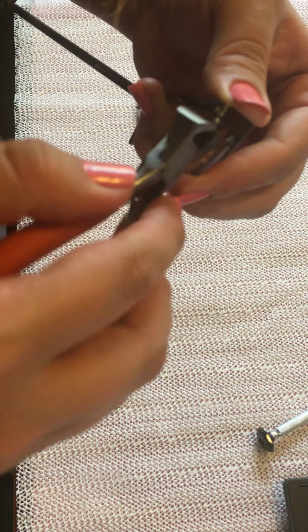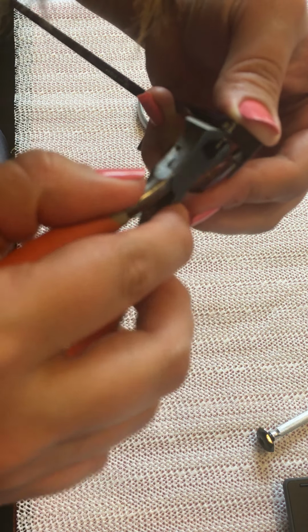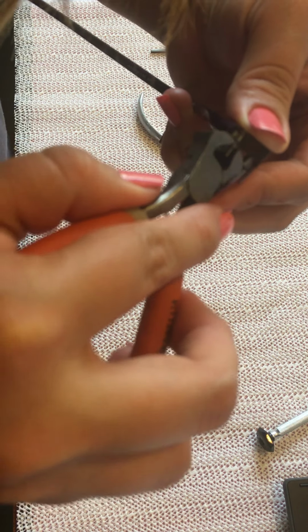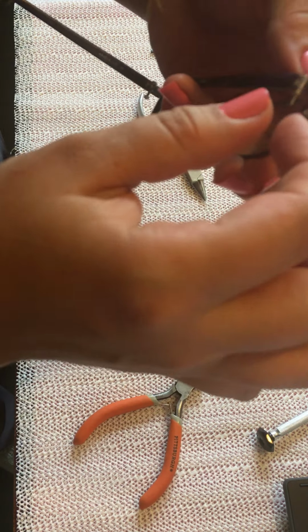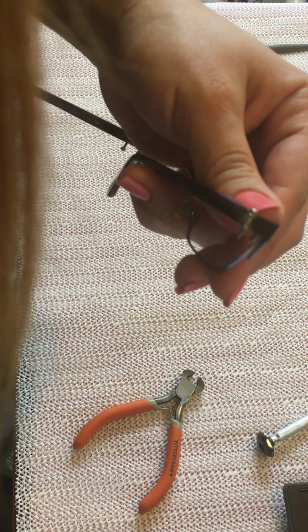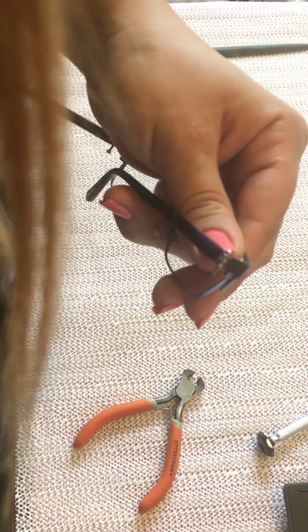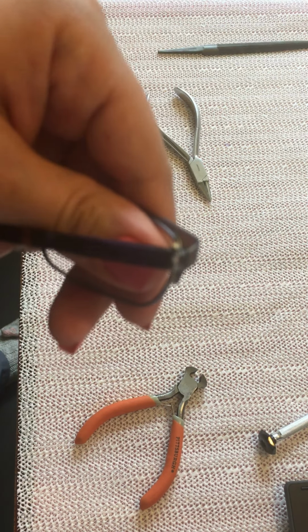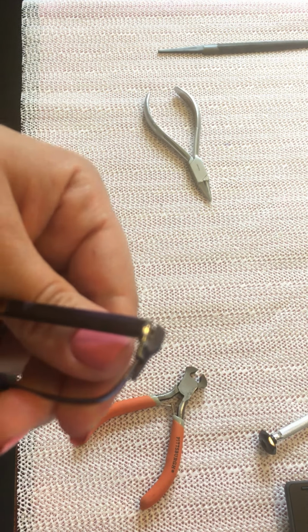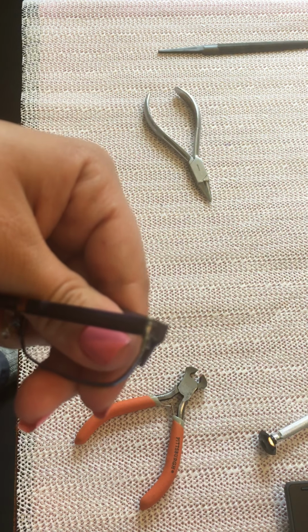I'm pressing with my thumb so the actual bolt doesn't come out, and I am twisting it, being careful with my clipper. I'm twisting the nut all the way as close as I can in order to hold it in place. Okay, there's marks here.